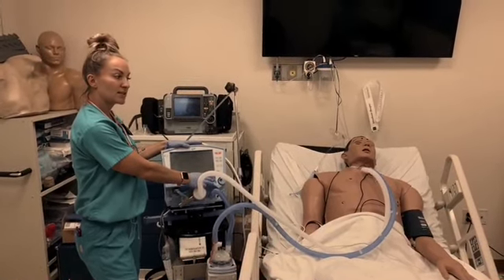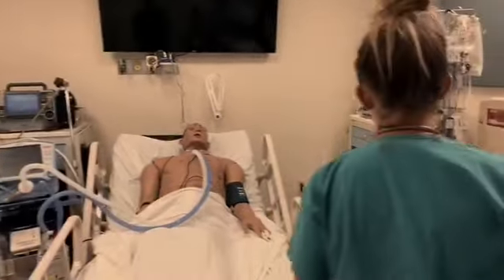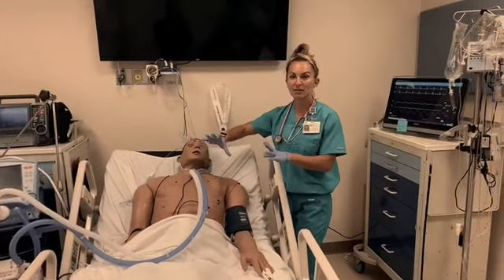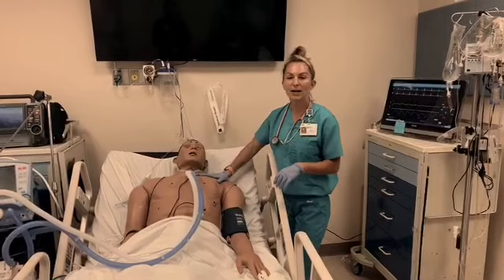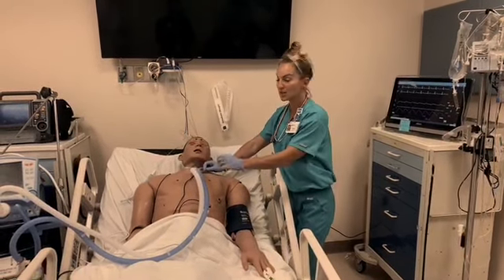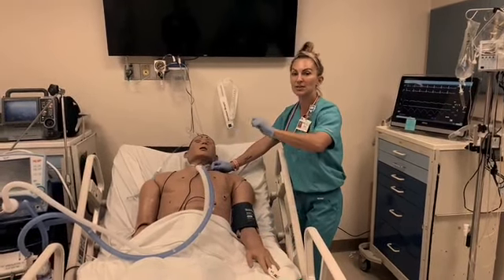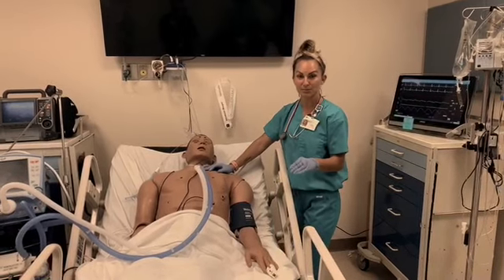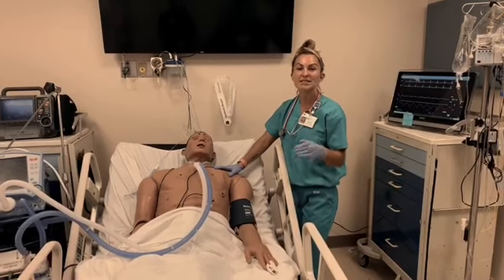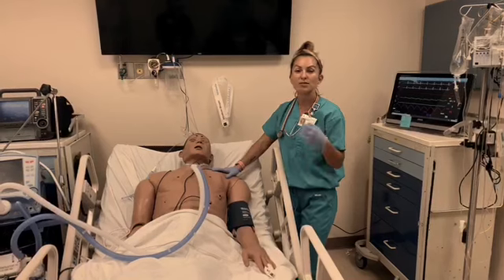If by any chance this is unable to be performed, you can also hyperoxygenate your patient utilizing an ambu bag at the bedside, connecting it to the tracheostomy, and pumping it. After you've hyperoxygenated your patient, you're going to want to perform the inline suctioning, maneuvering through the cannula. Suction on your way back out intermittently. You can do this up to 3 times. Now this is troubleshooting if you see that they have started to desaturate, and it could be because of increased secretions. Another complication is risk for bleeding.